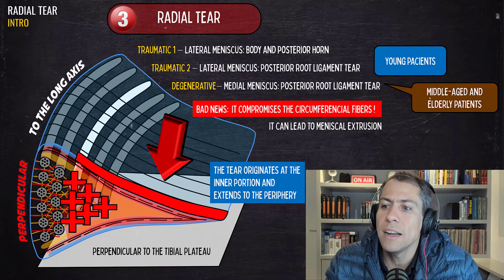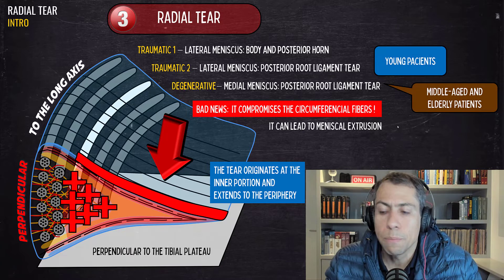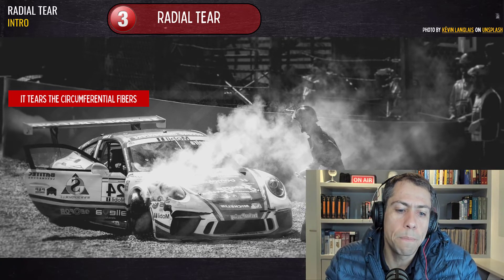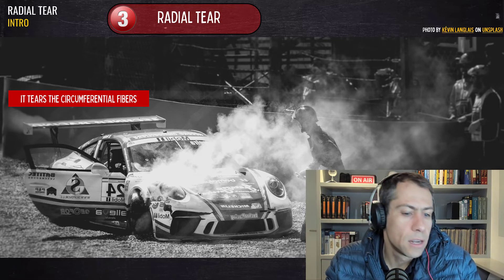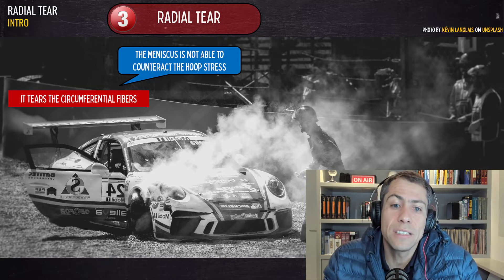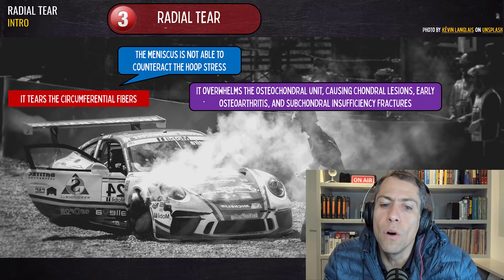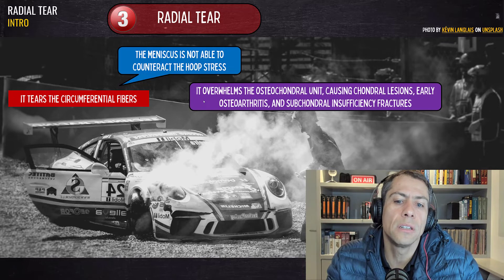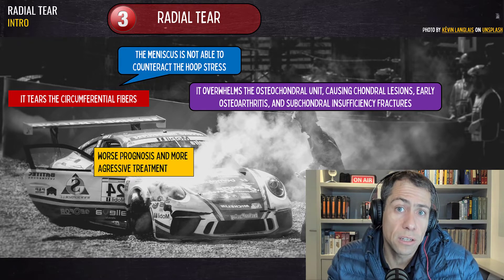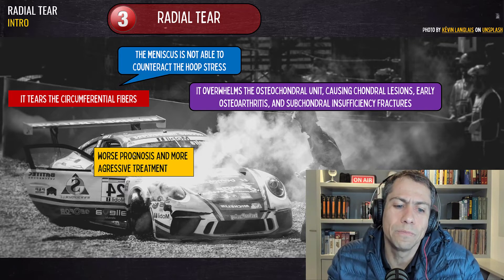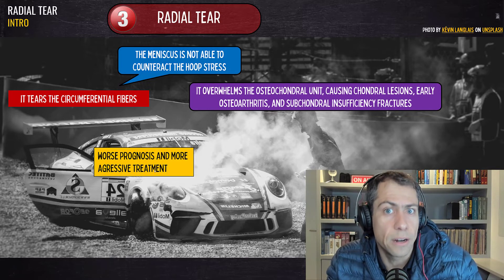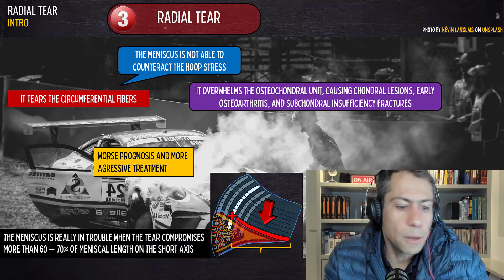The posterior root ligament tear of the medial meniscus is a degenerative tear occurring in middle-aged and elderly patients — the same demographics as horizontal meniscal tears. When a patient has a radial tear, the circumferential fibers are disrupted, and the meniscus can instantly lose its function if the tear is large enough. The meniscus then cannot counteract hoop stress, overwhelming the osteochondral unit and causing chondral lesions, early osteoarthritis, and subchondral insufficiency fractures. Large radial tears have a worse prognosis and deserve more aggressive treatment compared to horizontal or longitudinal tears.